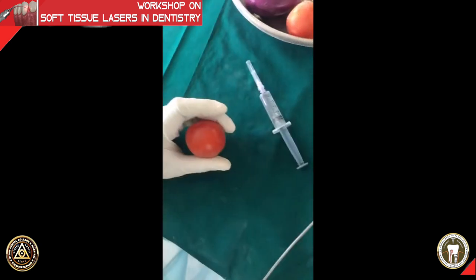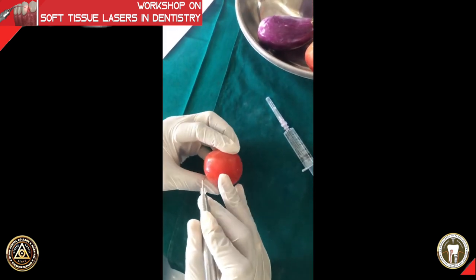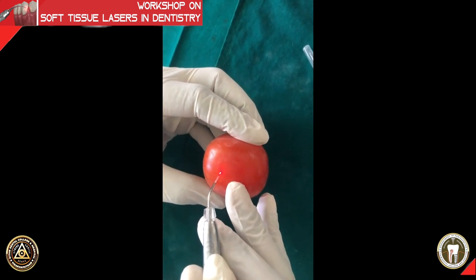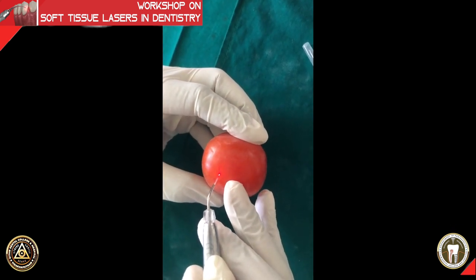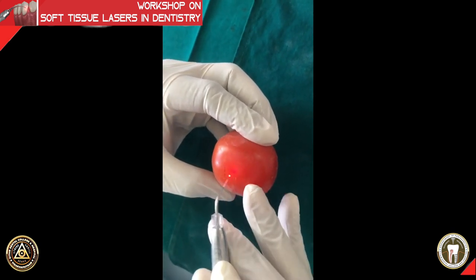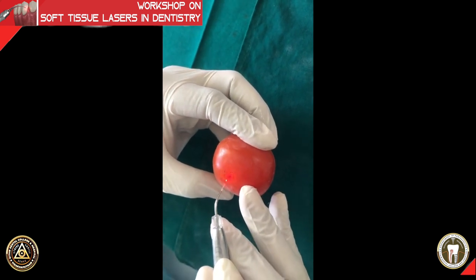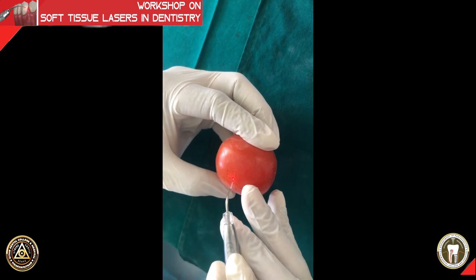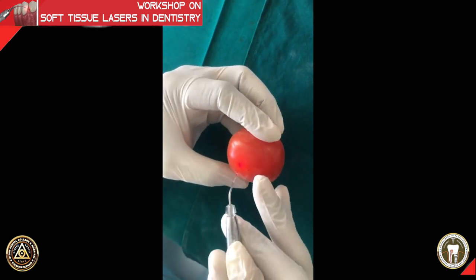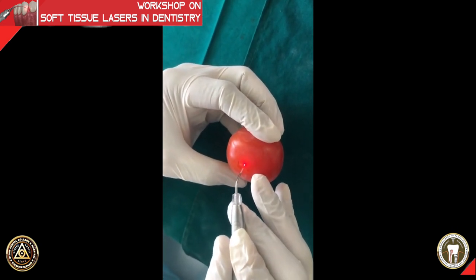Sir is going to make a small outline to mark the area where he is going to de-epithelialize. People do de-epithelization in two different ways: one is making scratches horizontally and vertically like children scratching with crayon on paper. Others make small pinpoint holes as sir is showing now, and then wipe off the tissue. Both methods are acceptable.